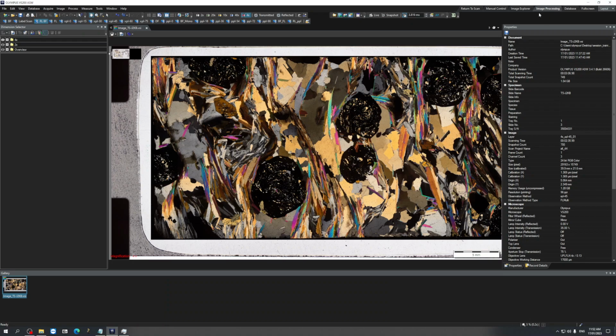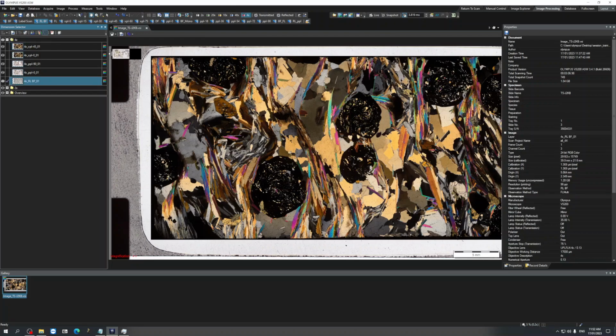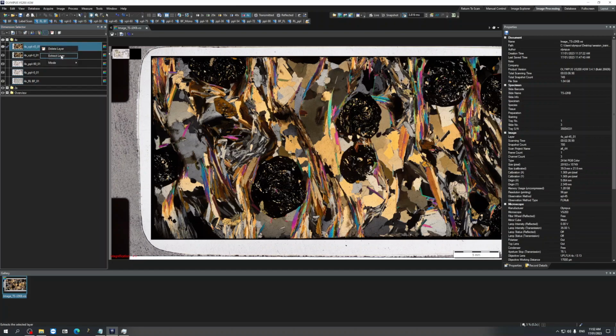In the image processing tab, you will see the image once it's opened from your local disk, and you can navigate this image, but it's not as interactive as using a set stack. Therefore, we recommend following this procedure of extracting the layers from the image data tree, and that can be done individually.